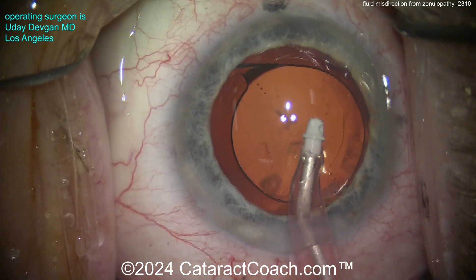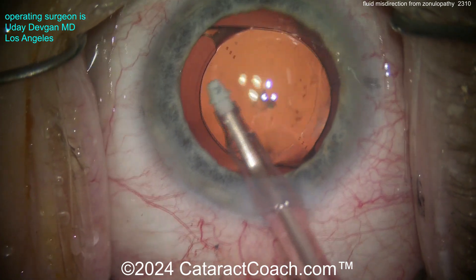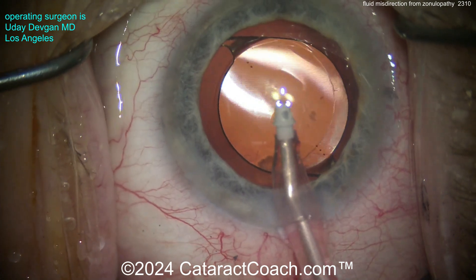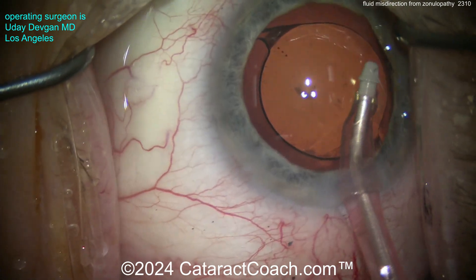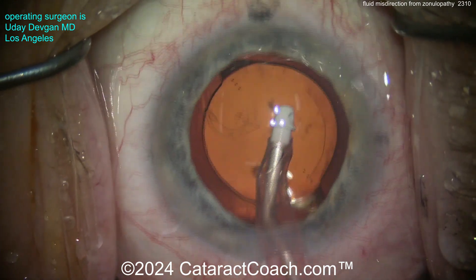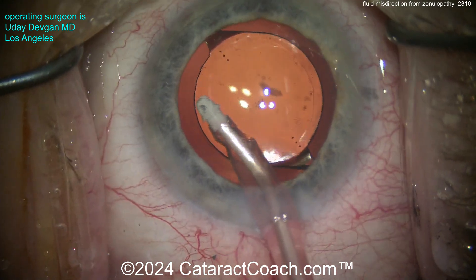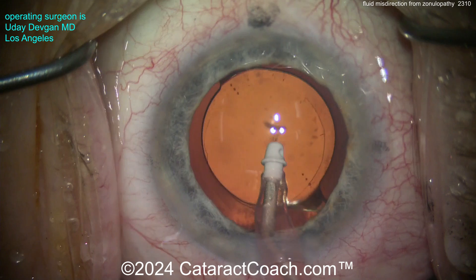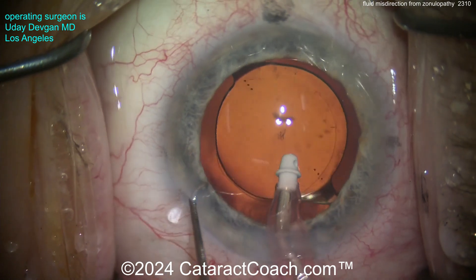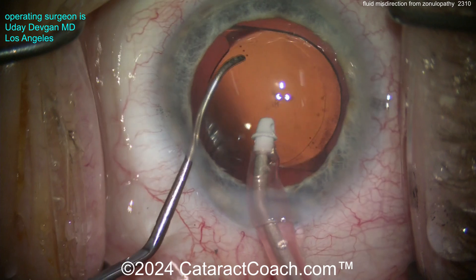If you drop a quadrant of nucleus into the vitreous cavity you need to do a pars plana vitrectomy, pars plana lensectomy. But in this situation, look at those tiny little pieces — bigger than you're used to seeing, but there are some significant pieces of lens material. Could you do an anterior vitrectomy, go pars plana and just aspirate those two? Yes you could. Do you need to? I don't think you do.